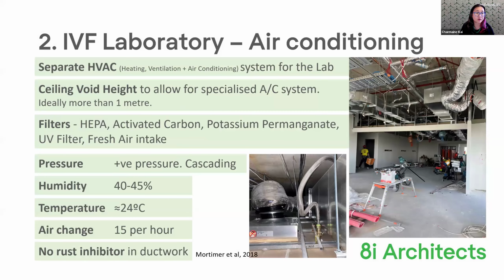So the first thing we're going to talk about is air conditioning. When you are designing a new lab or refurbishing a lab, generally it'll be within an existing building space. If you are lucky enough, you might go into a space that's brand new and purpose built for a lab, but in general, you'll probably go into an existing building.